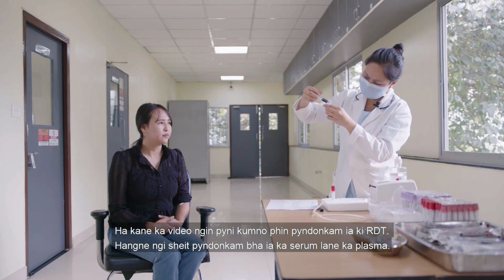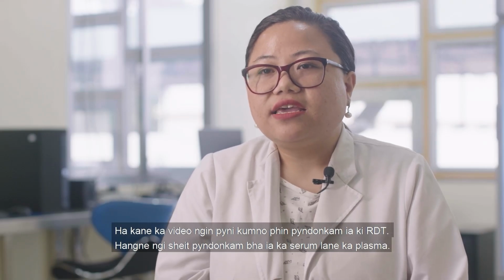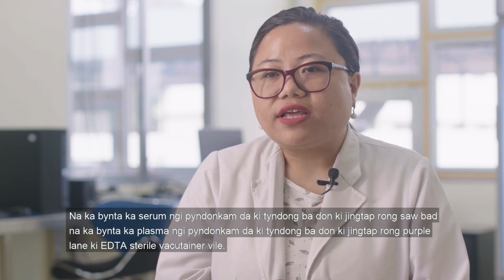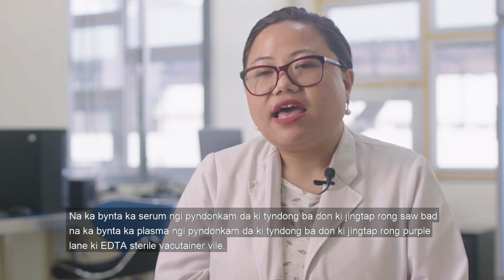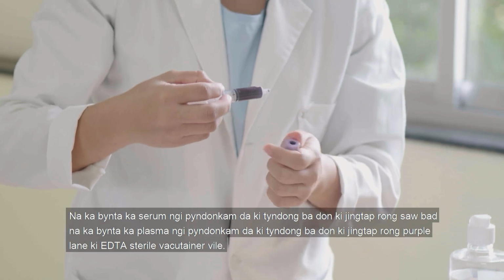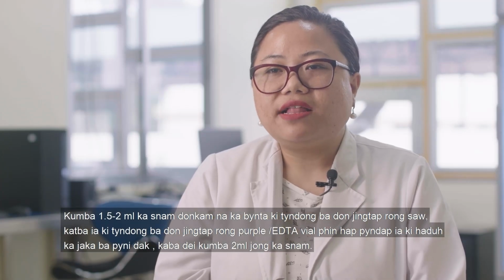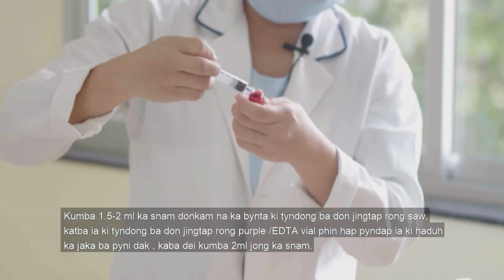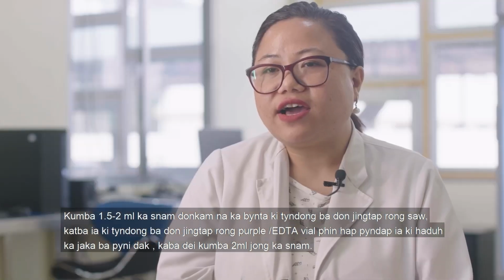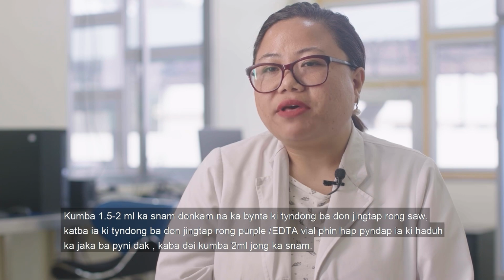In this video, since we are going to be showing a tutorial for how to use RDTs, here we mostly use either serum or plasma. For serum, you use a red capped Vacutainer sterile vial, and for plasma, you can use a purple capped or an EDTA sterile Vacutainer vial. At least 1.5 to 2 ml of blood is required for a red capped vial, whereas for a purple colored EDTA vial, you are going to fill the vial up to the marked area, which is most commonly up to 2 ml of blood.